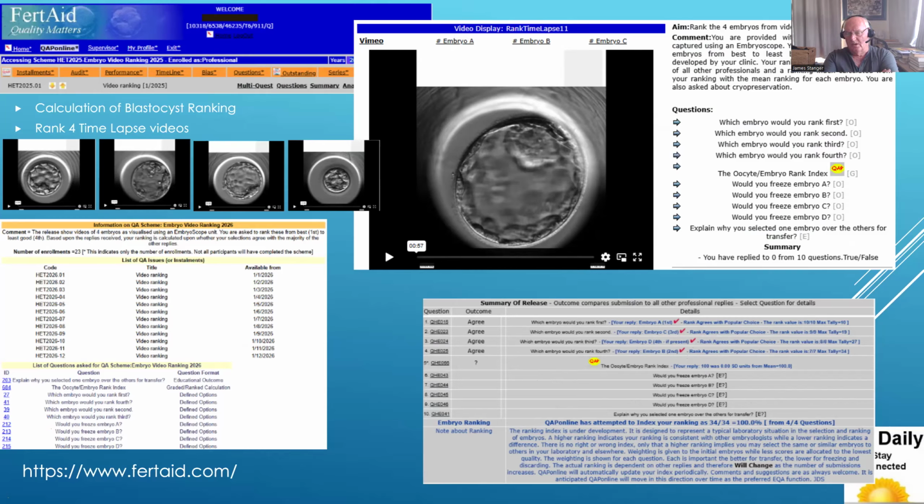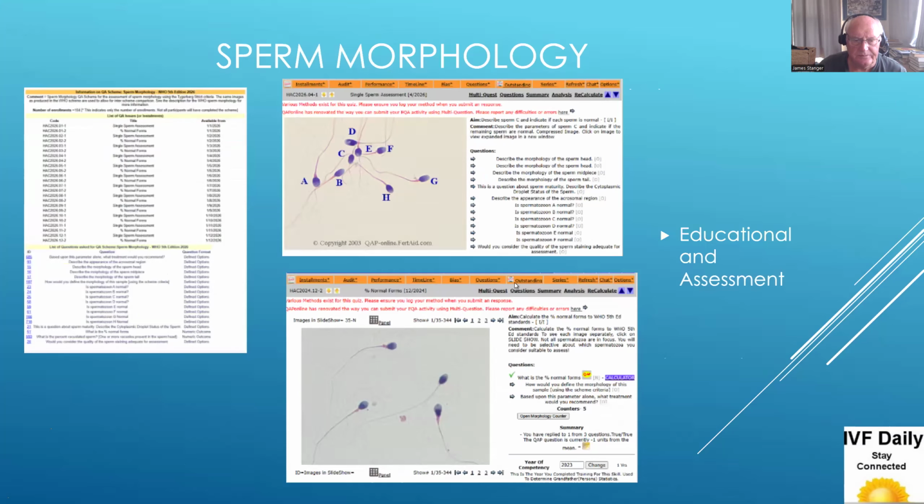So when you look at the standard deviation graph, instead of looking at the mean, what you're looking for is people above the mean that are ranking correctly. I haven't done that particularly well, I must admit. I did this back about 2006.